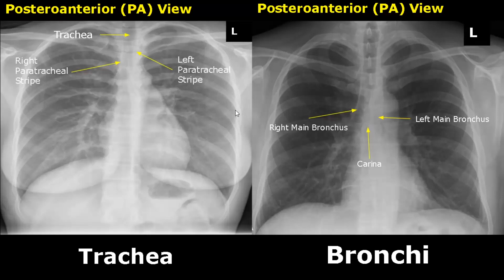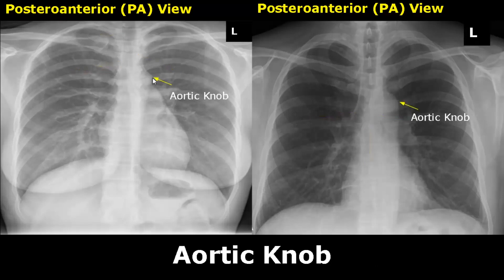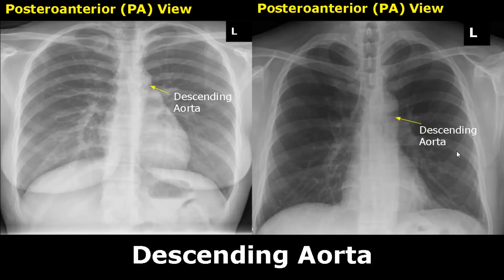The aortic knob contains the aortic arch. It can be seen bulging laterally here. The aortic knob further continues as the descending aorta, which is seen below the aortic knob at this point right here.